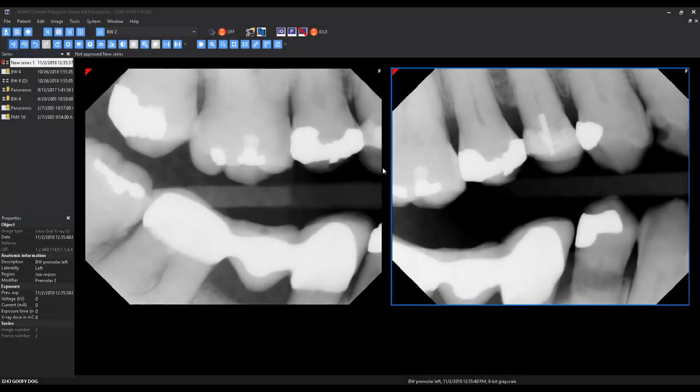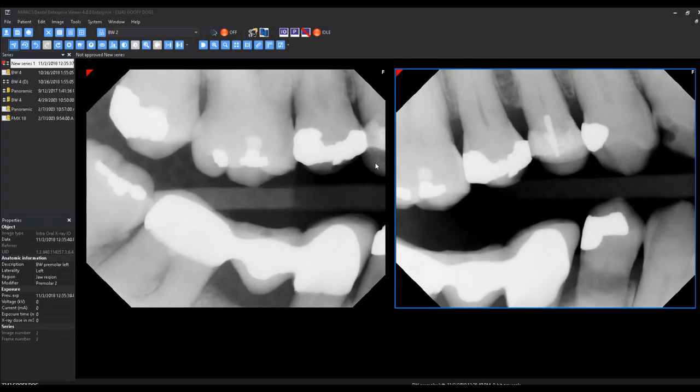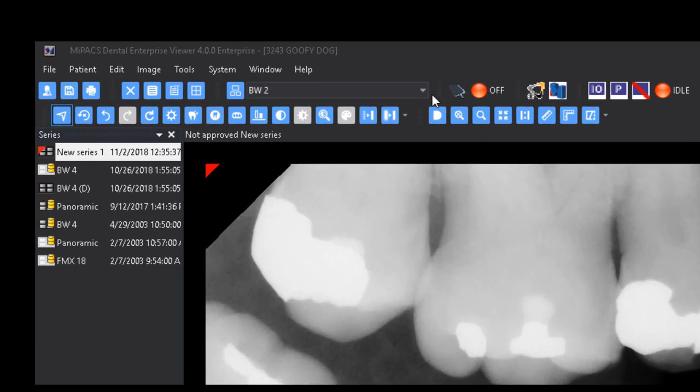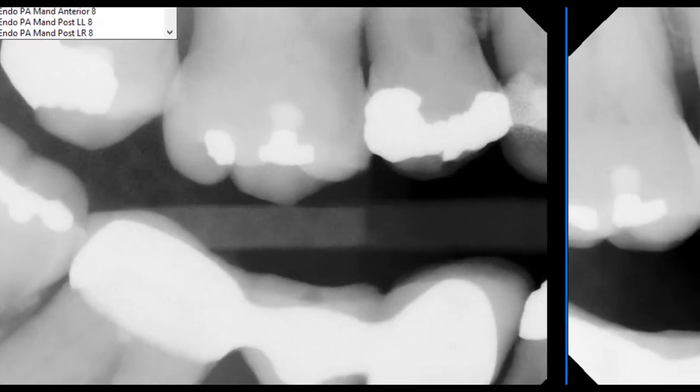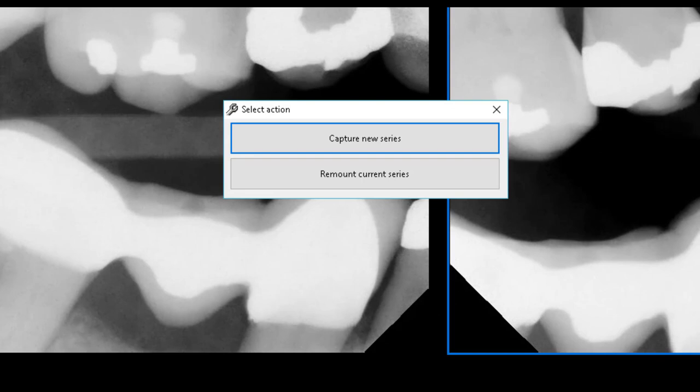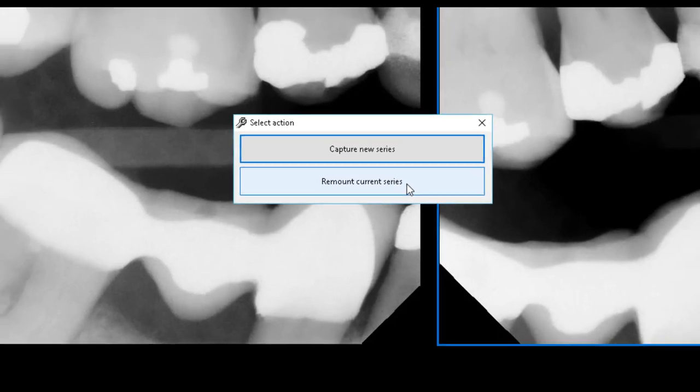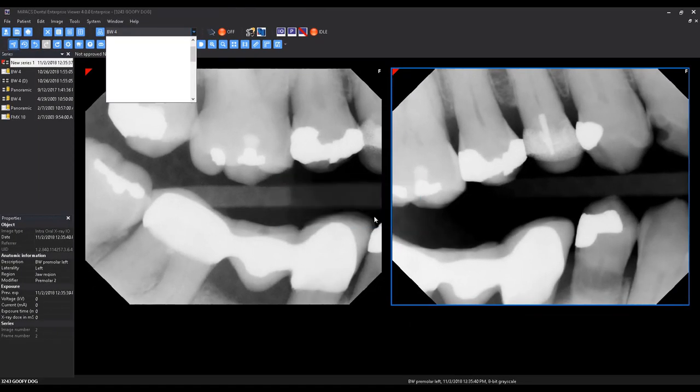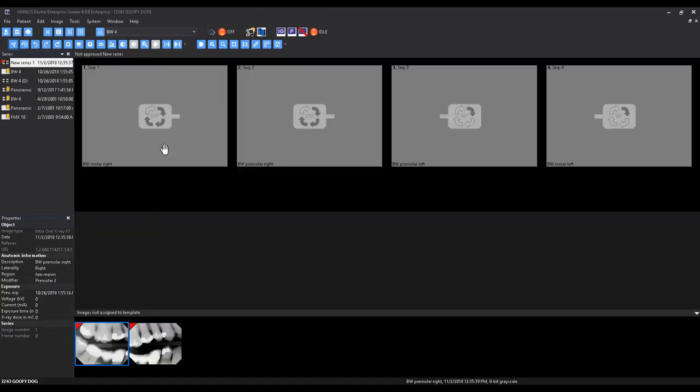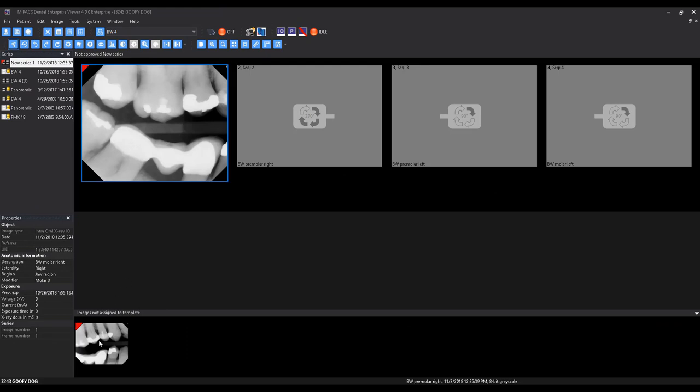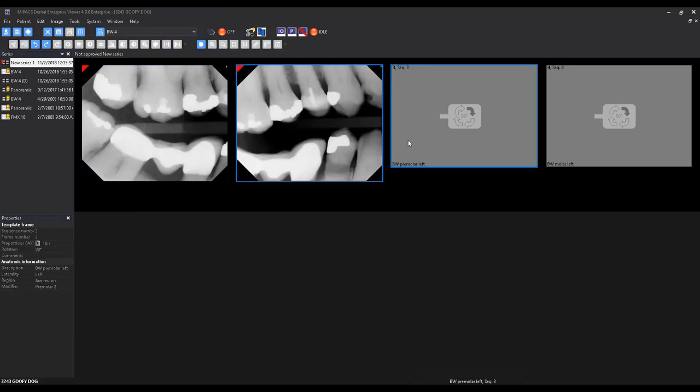In the event a different template is required after images have been taken and they are still unapproved, simply select a new template from the drop-down menu and select Remount Current Series. Then left-click and drag images into their appropriate spots in the new template. You may then take more images to complete the new series.